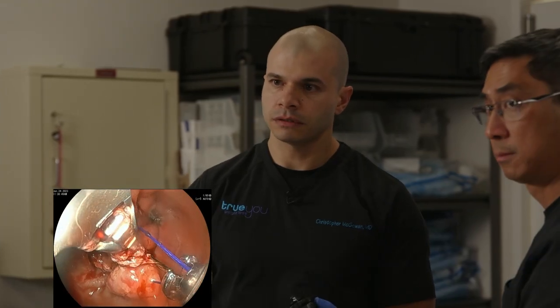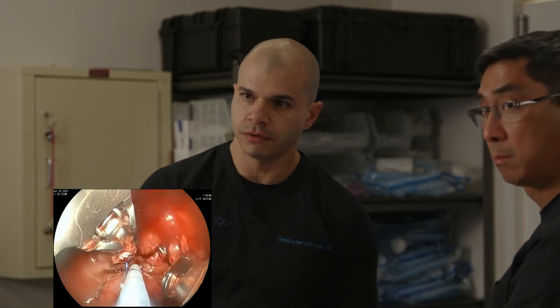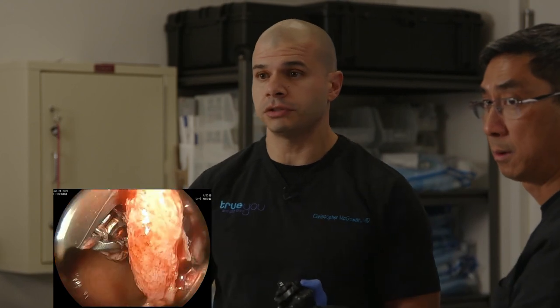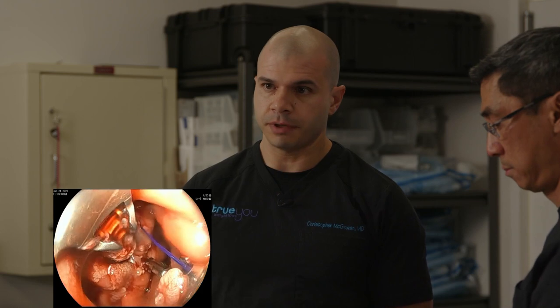How do the risks of this procedure compare with the bariatric revision? Yeah, vastly different risk profile compared to a surgical revision. If you look at studies of surgical revision, the complication rate is quite high. Depending on the study you look at, anywhere from 10 to 30% complication rate. That is very high. With this, it's less than 1% owing to the endoscopic approach.